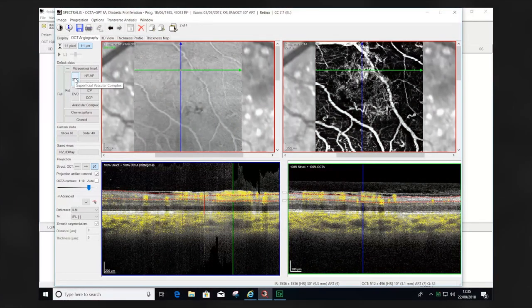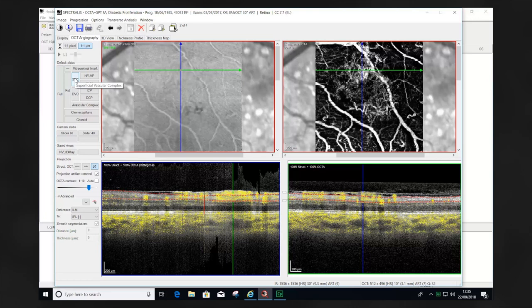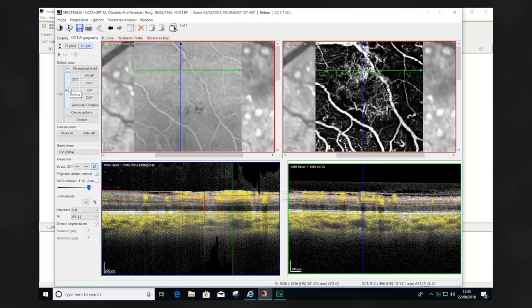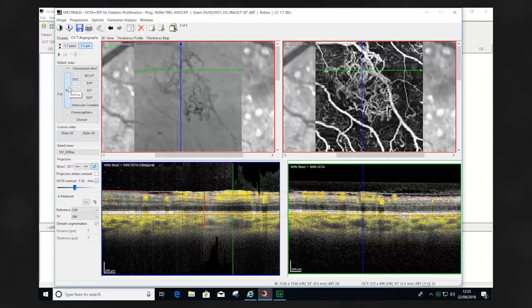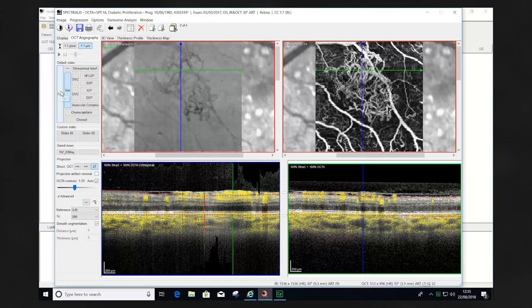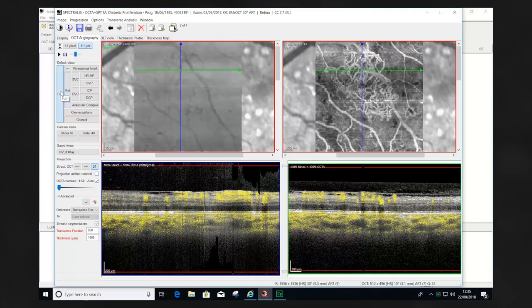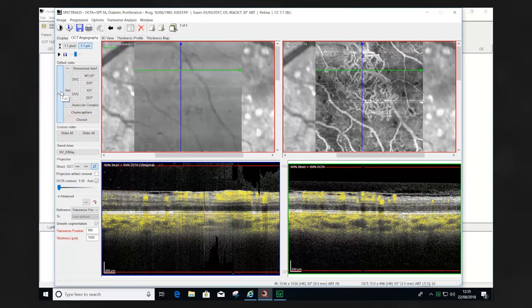In this example of a patient with neovascularization elsewhere, the superficial vascular complex position does not completely identify the extent of the neovascularization elsewhere. Using the retina and the full segmentation positions allows us to appreciate the neovascularization information elsewhere more clearly.